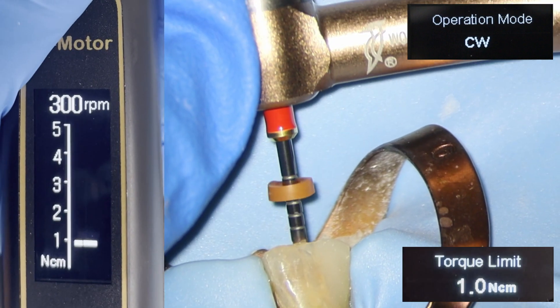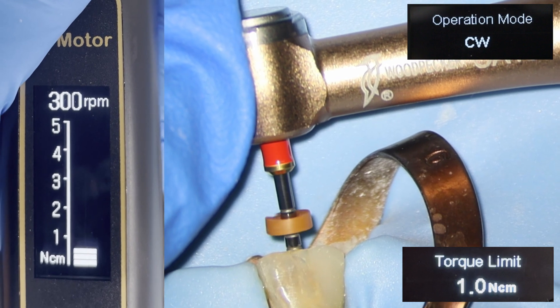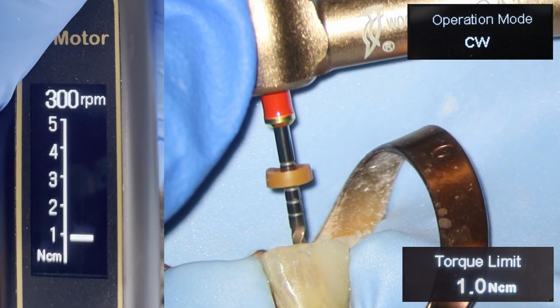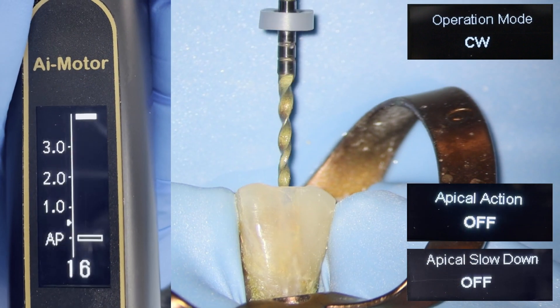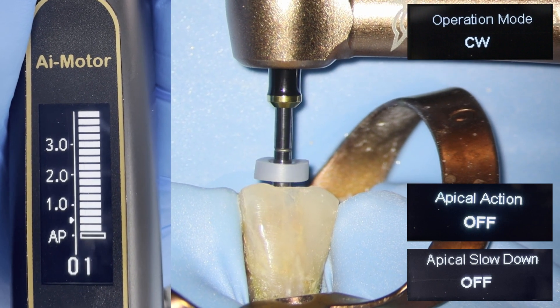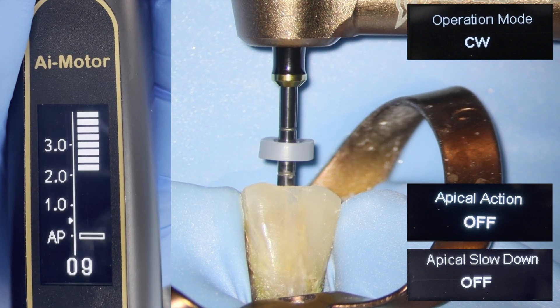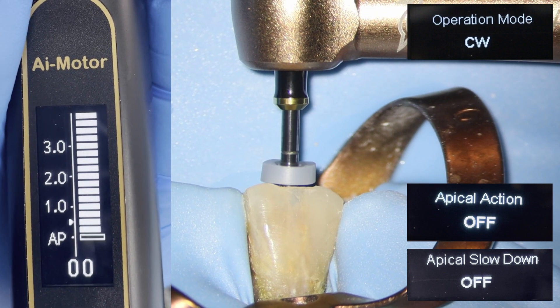A torque limit can also be applied where the file is rotated in the opposite direction when a specific limit has been reached. There are two modes significant when using the Apex Locator during operation: apical slowdown, which is self-explanatory, and apical action, which is what the file does once it reaches the apex.